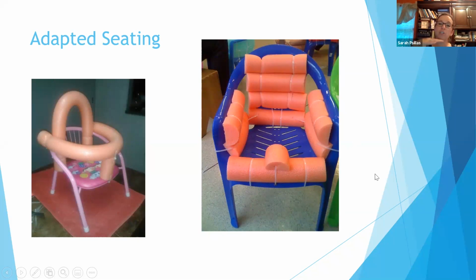And then the front piece right here, it's hard to see in this picture, but when the person sits, it brings their hips all the way back in the chair, almost at a slight angle, so that they can keep their pelvis all the way back. It also has the centerpiece that's sort of like a pommel to keep their legs separated so they're not getting constant pressure between their knees or their thighs, which can cause skin breakdown as well.